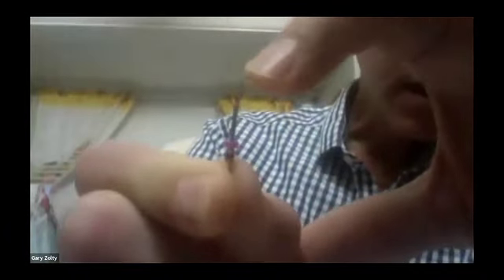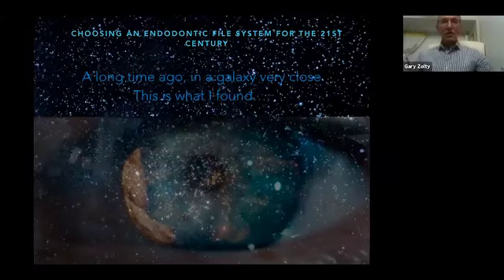Right. I'm bending it, and as I bend it with a lot of force, we can see that it springs back to almost its original position. So a canal that's curved, as it rotates, it doesn't hold that position and cause that change in the canal. It will spring back and bend as it rotates along.